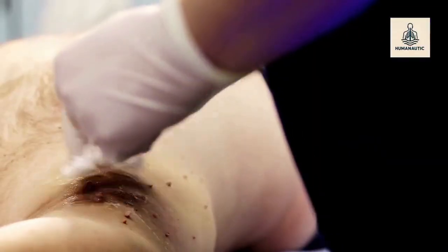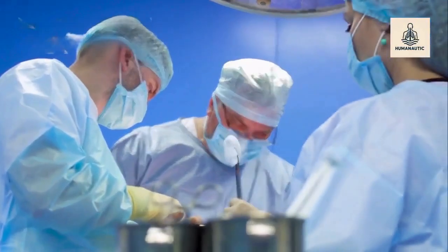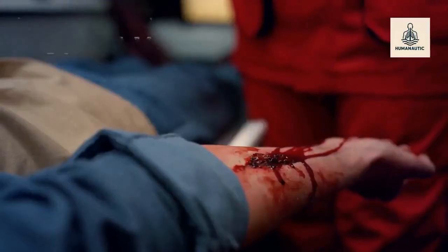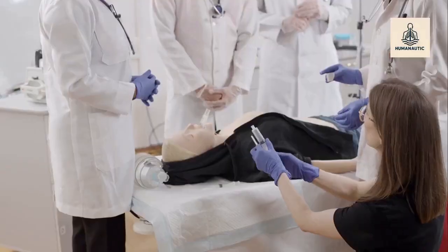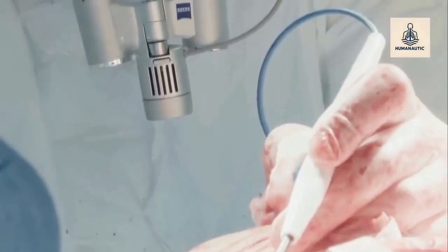Step 4, debridement. Use a scalpel or scissors. Remove all non-viable tissue. Continue until healthy bleeding margins appear. Preserve viable tissue. Step 5, hemostasis. Control bleeding using pressure or cautery.